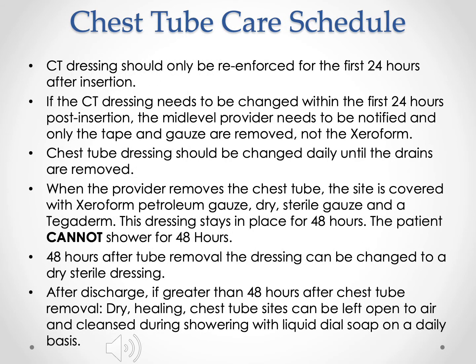Chest tube insertion care schedule. The chest tube insertion site dressing should only be reinforced for the first 24 hours after insertion. If the chest tube insertion site dressing needs to be changed within the first 24 hours after insertion, the mid-level needs to be notified. If you're instructed to change the chest tube dressing, only the tape and the gauze are removed. Do not remove the xeroform.